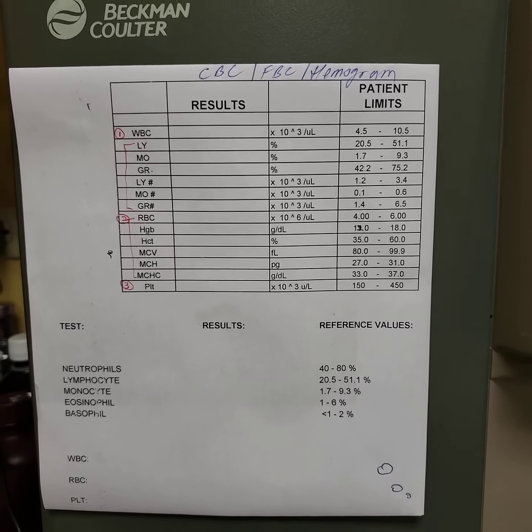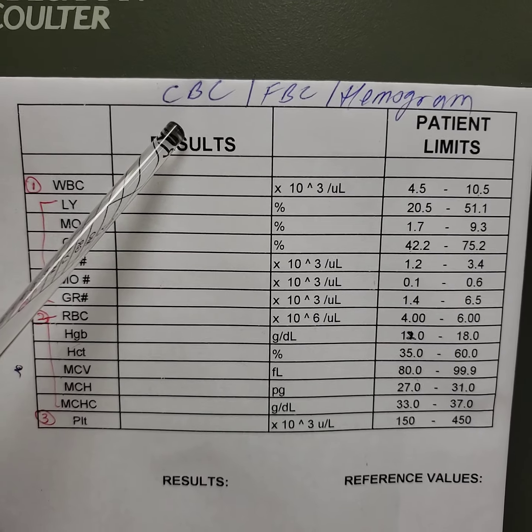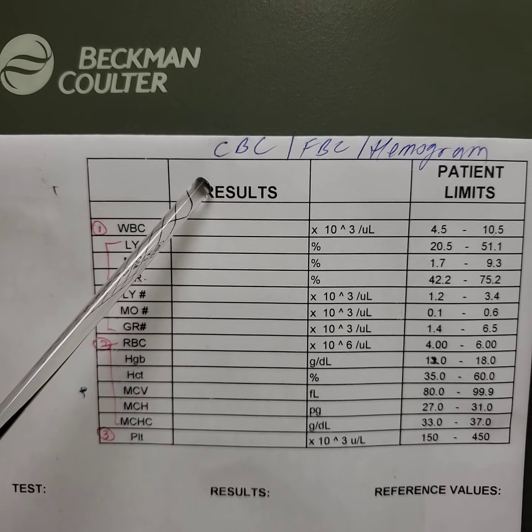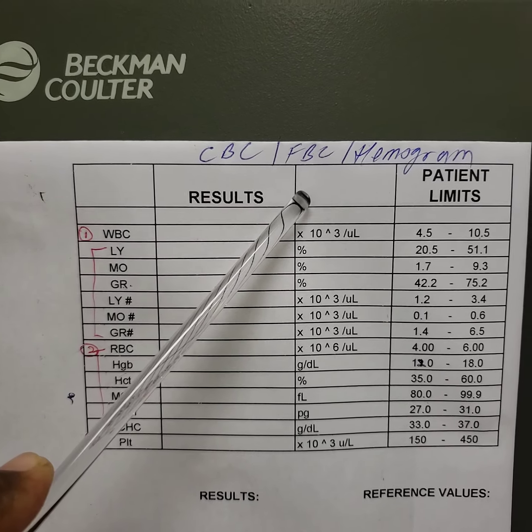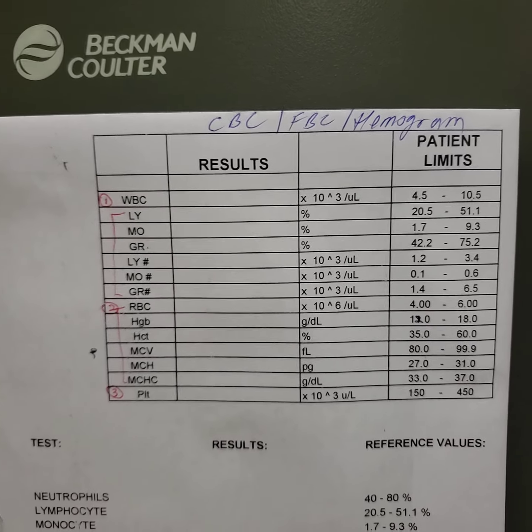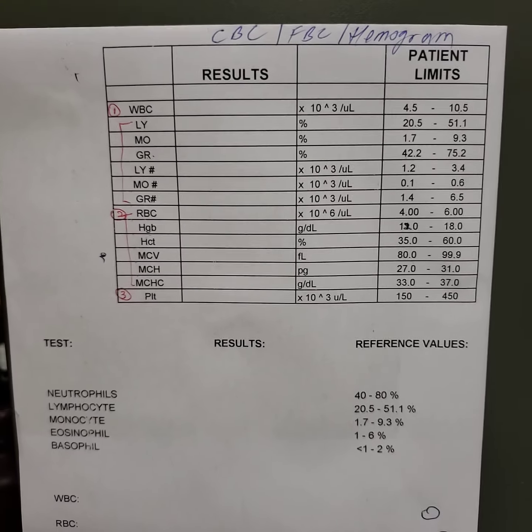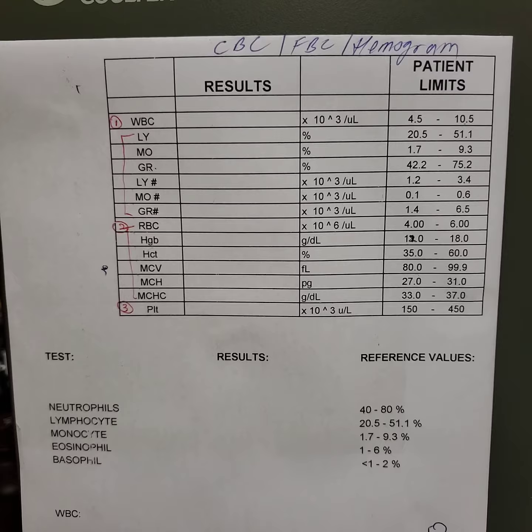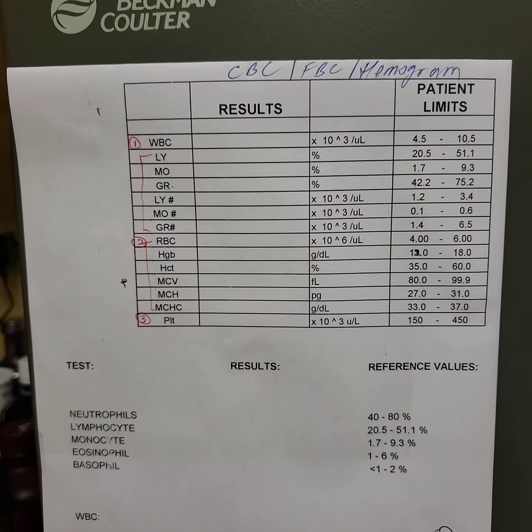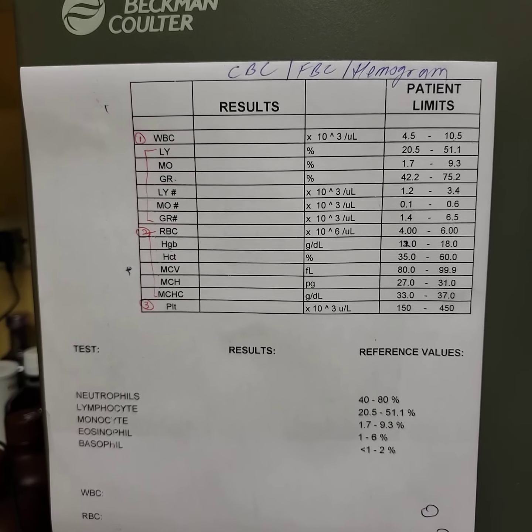I wanted to hopefully bring some light to a very important test called the CBC, FBC, or hemogram. CBC for complete blood count, FBC full blood count, and it's also called a hemogram. This is one of the most important routinely requested tests by a physician. Many of you as patients would probably receive a referral letter from a doctor where this test may be one of the most frontline tests he or she may ask for.